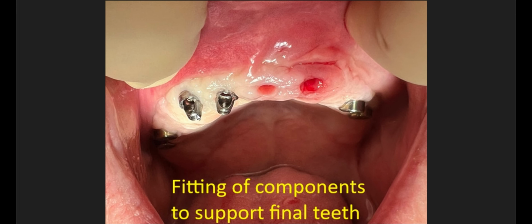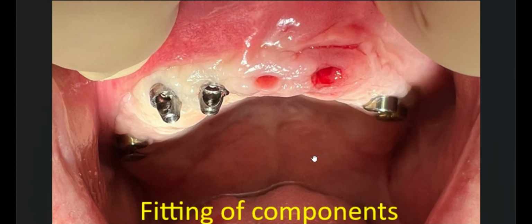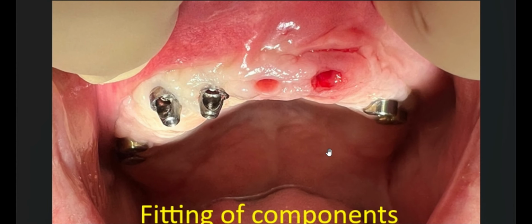Now what we've had to do in this situation, because the previous dentist placed the implants in a strange angulation, the screws would have headed out to the front of the teeth and protruded through the front surfaces of the teeth. So we've had to use special components to re-angulate the screw holes appropriately. So 2 similar ones will be placed in this area here, and these little healing buttons will come out, and these will have direct to implant connection with the prosthesis as we've designed them.